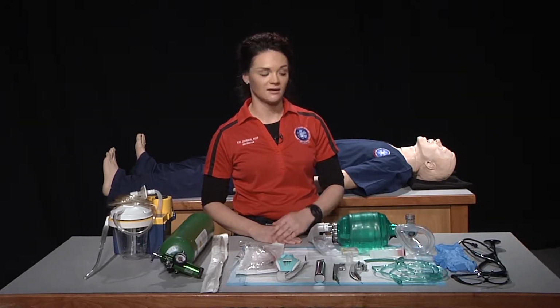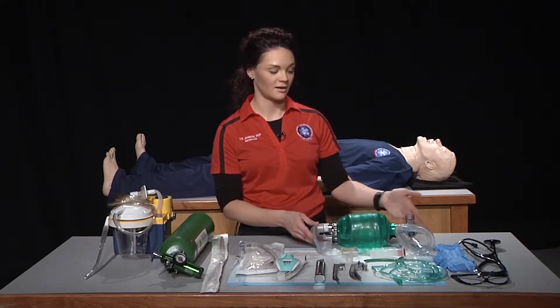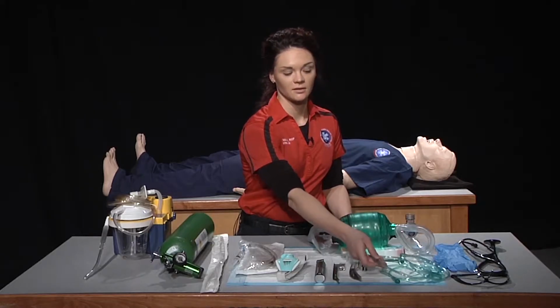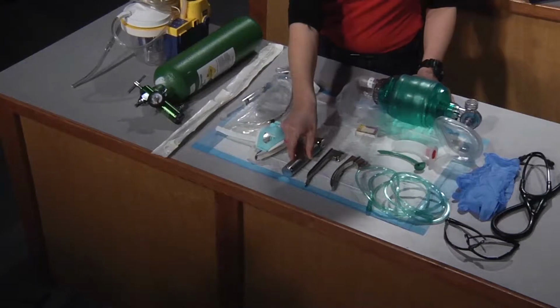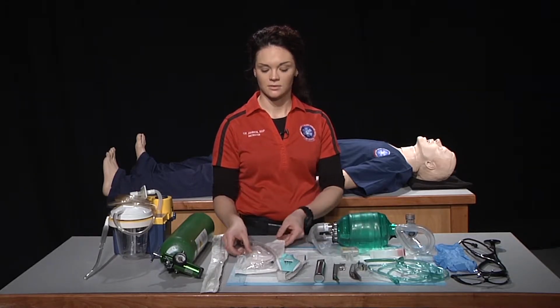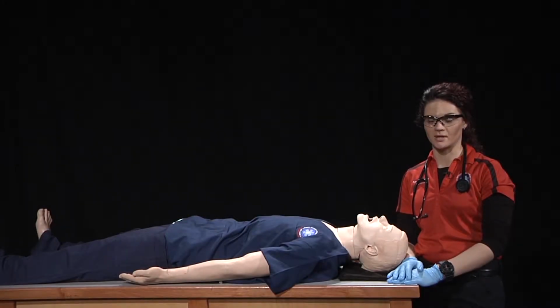For this skill, we will need a stethoscope, the appropriate PPE, which will be gloves and eye protection, a BVM with reservoir bag and mask, airway adjuncts, oxygen tubing with our oxygen tank and regulator, our colorimetric device, a laryngoscope handle and blades, an ET tube with stylet and syringe, a securing device, and a suction device with the appropriate catheters. Now that we've assembled our equipment and applied the appropriate PPE, we're going to prep our patient.